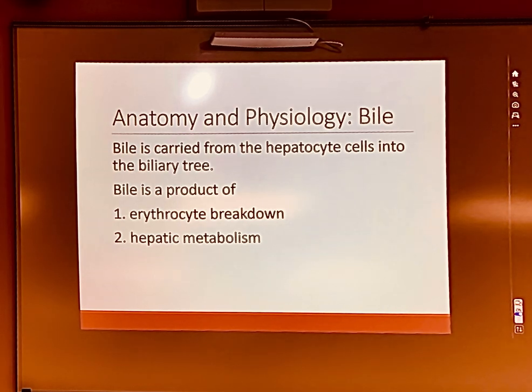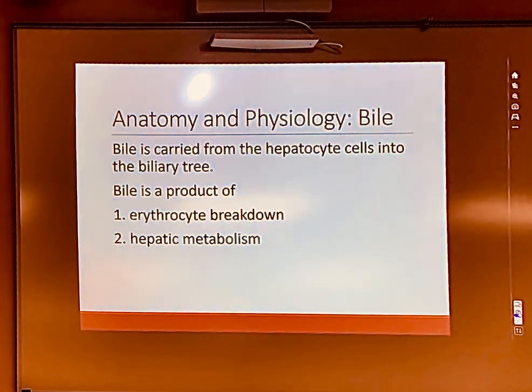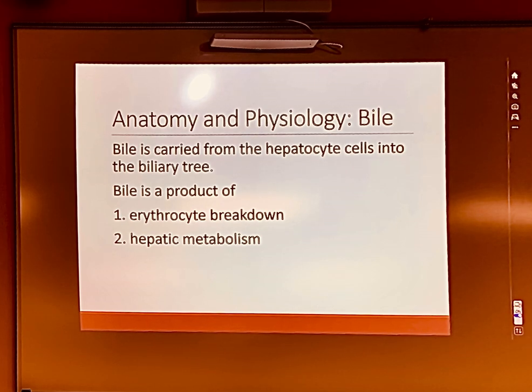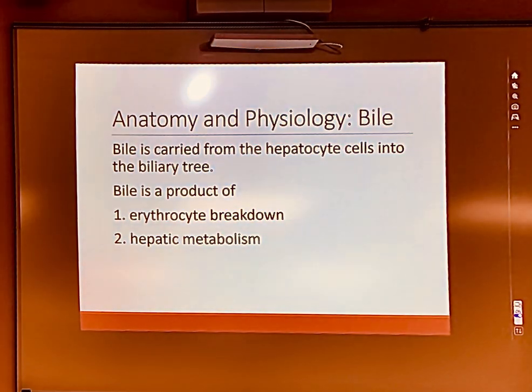And they're going to do something called protocol. They're going to protocol your patient. When they protocol your patient, they are going to go into the patient's medical record and look at their ultrasound, their other imaging studies, and their labs, and they're going to say, okay, I want you to give this much activity and take a picture this way, this way, this way, and this way, and then bring it back to me when you're done.